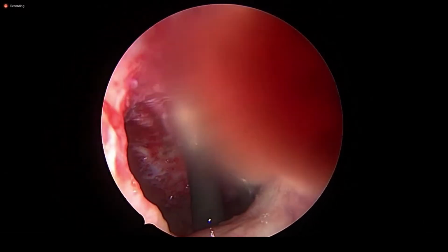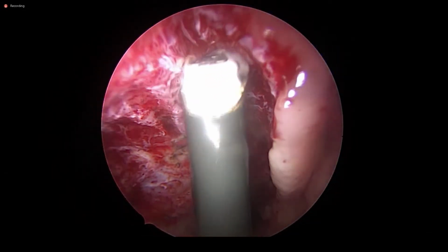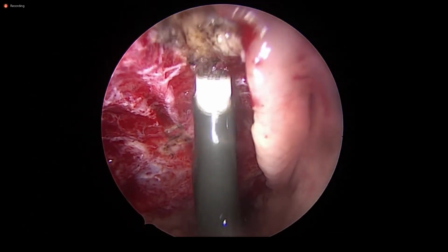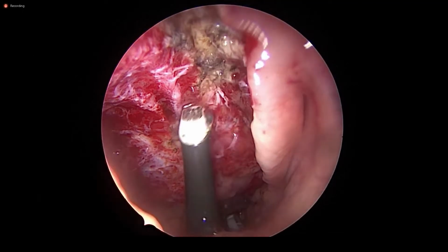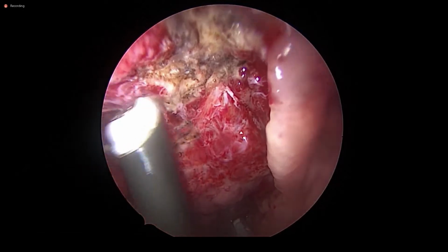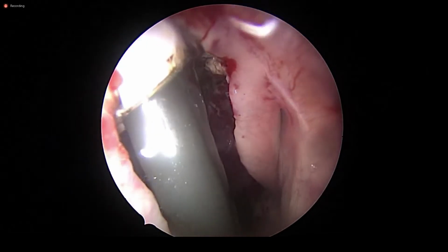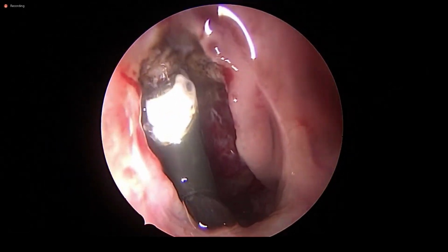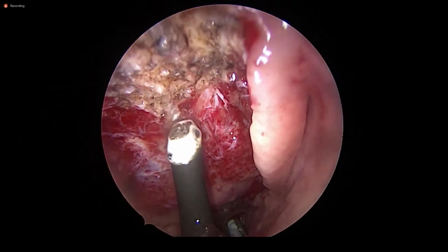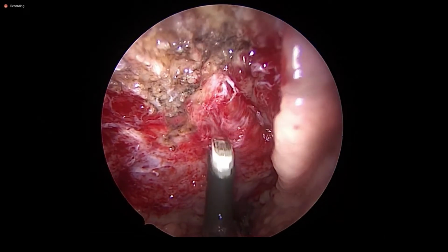In order to prevent that, now I will do extensive carpet coagulation to the periosteal region. See this? This is called carpet coagulation. Can you see this? Since there is no muscle underneath, it is absolutely harmless. Can you see? Yes, sir. But this is a sort of insurance to avoid post-operative hemorrhage. I am not doing carpet coagulation below, here on the muscle.